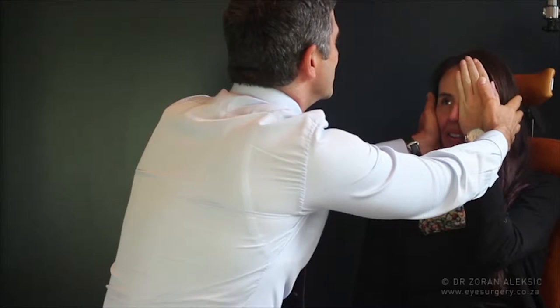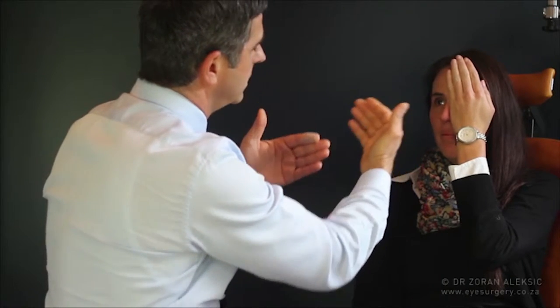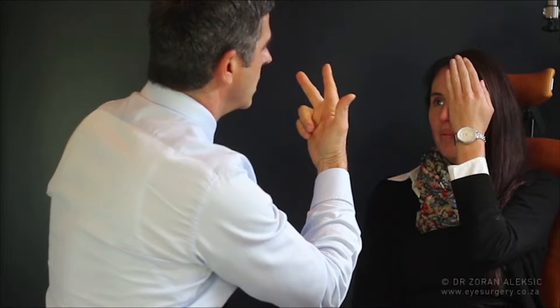The next step is to ask the patient to close their left eye and keep looking towards you. At this point you are at 30 to 40 centimeters distance, and we ask the patient to tell us how many fingers they see.